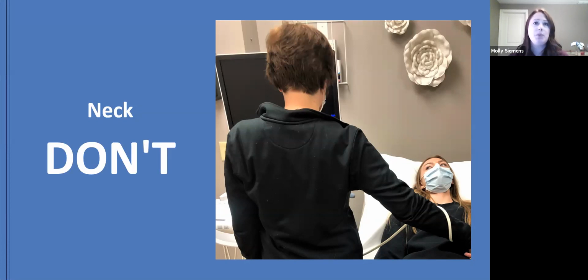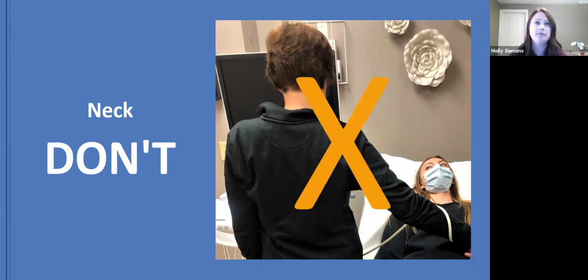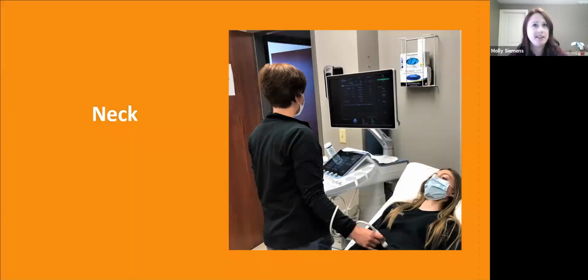One such abnormal posture is demonstrated here, keeping our head tilted down in order to see the monitor. Obviously, the easiest solution is to make sure that the monitor is adjusted to an appropriate height for you. The monitor should be kept at eye level at a position where your chin is neither too extended nor too flexed. So we're going to do that by keeping the neck vertebrae in a nice neutral position.